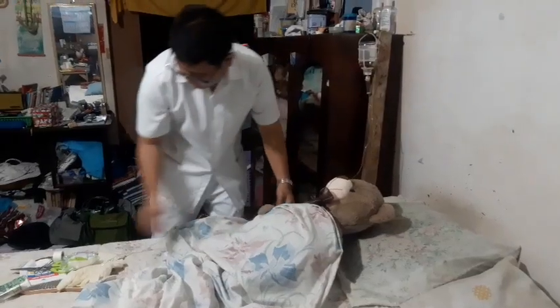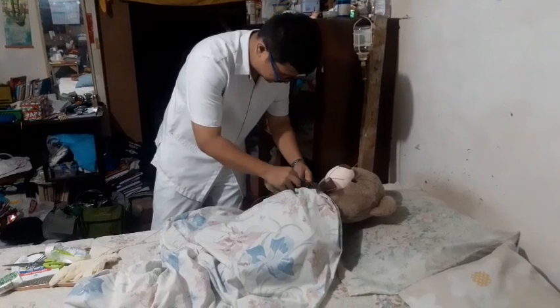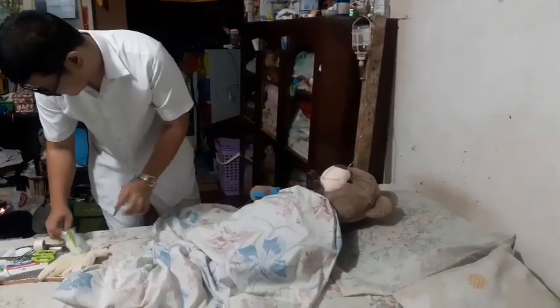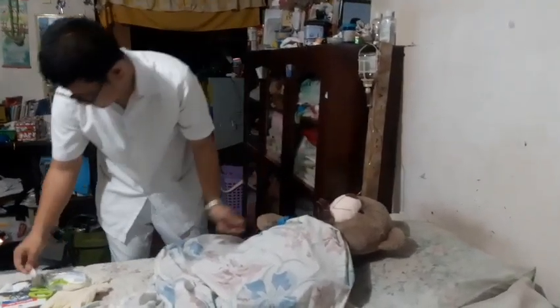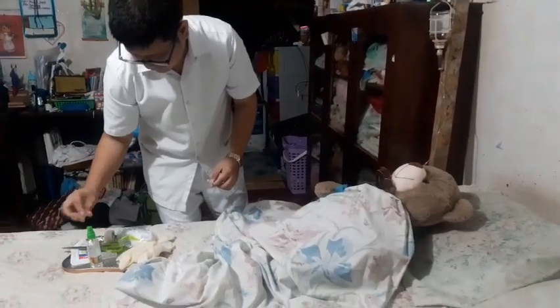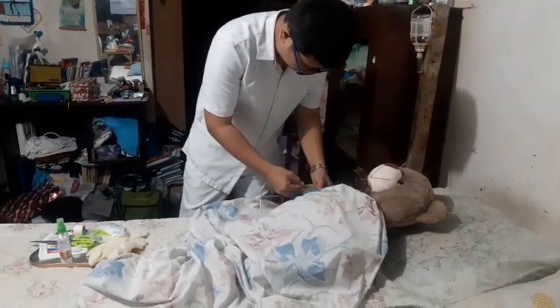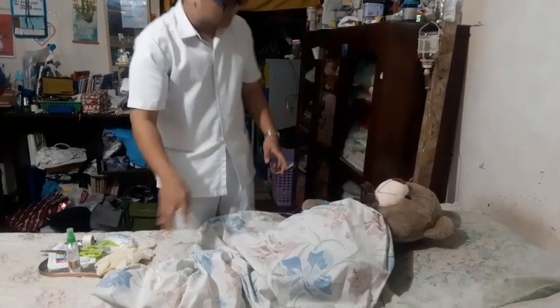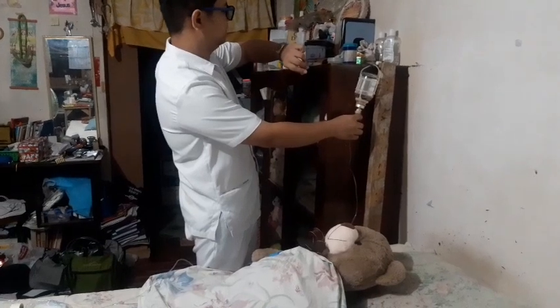We have now the monitoring of the intravenous infusion. In monitoring, assessment includes the operation of the infusion site, patency of the system, the type of fluid being used, the rate of flow, and the response of the patient. Review all appropriate materials and confirm the type of tubing, the controller, and the pump being used. Observe the flow rate, inspect the patency of the tubing and the needle, and make sure to inspect the insertion site for fluid infiltration.